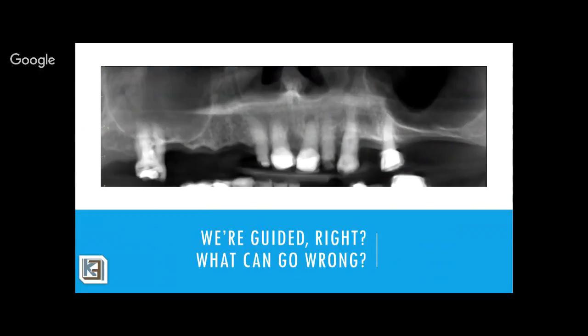A lot can go wrong if you're not very careful, especially in endo, because a little bit of deviation or a little bit of over drilling, as with implant surgery, is not really critical. Any deviation or irregularity in your drilling path in endo can lead to perforation. The problem is with endo, we are limited to the inside of the root. And as we go deeper and deeper, the root gets narrower and narrower, and our room for error gets smaller and smaller.